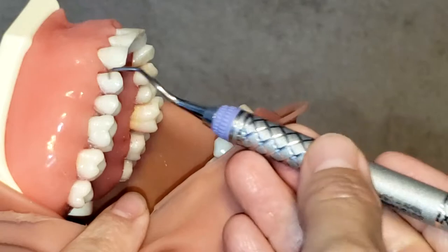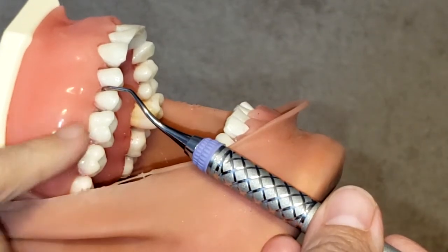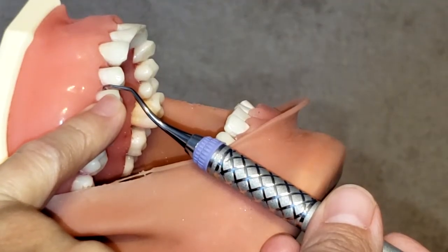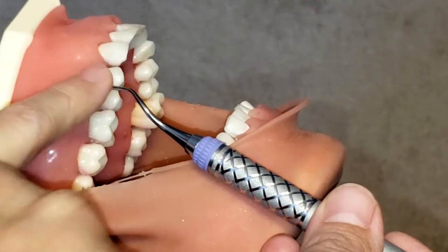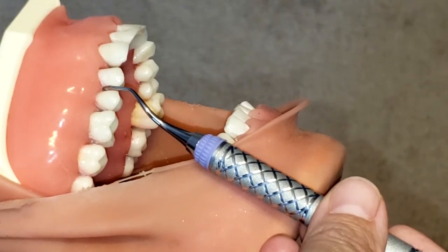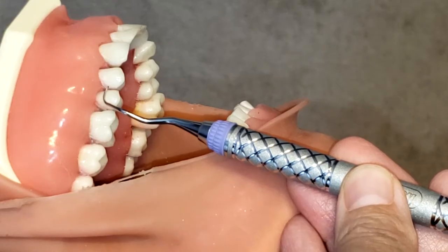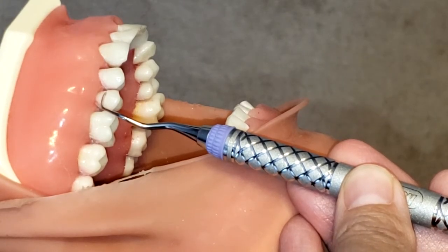If I were to place the instrument on the wrong side, you can see the lower shank is parallel to the long axis of the tooth, but now that V is created towards the mesial of that premolar — so I know that is incorrect. And if I were to place it this way, now the tip is sticking outward and it does not hug my tooth.